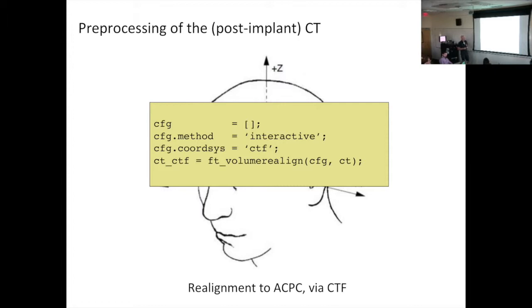So, just to be clear, the only overlapping aspects of the CT and MRI are the skull and surrounding tissues, basically. So how the fusion process is going to work is not based on brain anatomy, but on the skull and the skull tissue. So it's going to align those scans, so that the electrodes will appear, will be visible in the MRI scan coordinate system as well. We don't know if I click a point in the CT, it's not matched necessarily to the same point in MRI. So that's why we first bring them to the same coordinate system. Then we fuse them. And then we have, hopefully, an agreement between the location of the electrodes and the brain anatomy. And the reason you're using two different coordinate systems is because they're specific to the type of scan? Well, the ACPC system is a preferred convention for the FreeSurfer step.